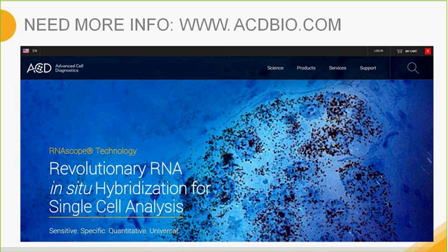One question is, which pretreatment reagents should I use with RNAscope 2-plex or fluorescent multiplex detection reagent kits? For optimal results, use the new pretreatment reagents, RNAscope hydrogen peroxide, target retrieval, protease plus 3 and 4, depending on your tissue types.